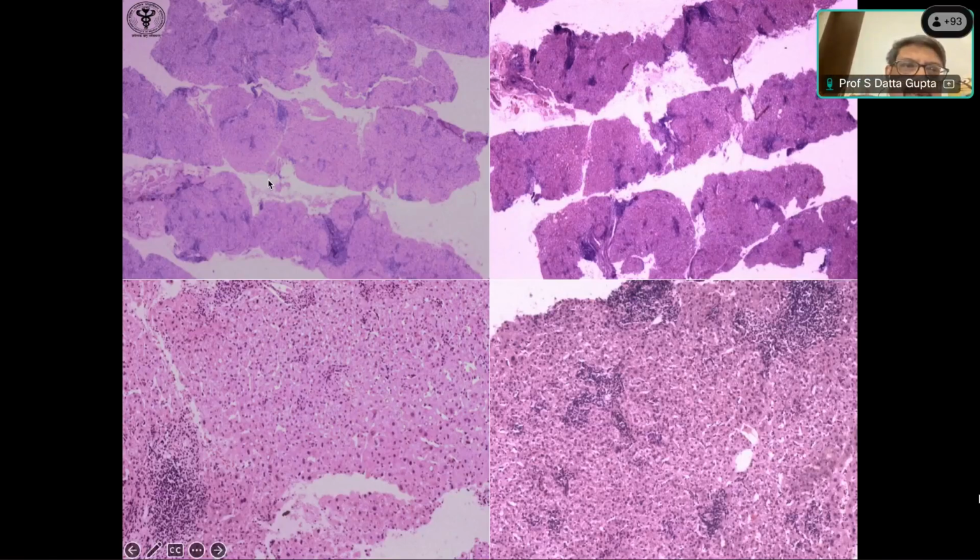So we know that the liver biopsies that we take, first of all, we see mainly needle biopsies. The first thing you must understand is that you must have good sections, and for needle biopsies, it depends on how thick you want to cut. Generally, most labs cut a little lesser than 5 microns. It's not necessary to be 2 or 3 microns like the kidney, where the basement membrane has to be seen very clearly. A little thick is all right. Some people cut at 5 or 6, but whatever it is, you have to be accustomed to the thickness of the section of your lab.